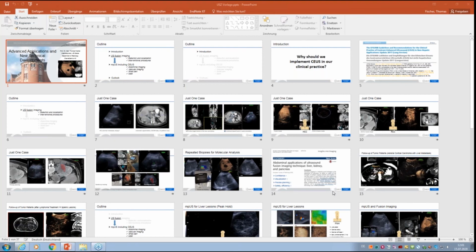Of course, in some cases, MR is superior. So we changed our setup. We used mostly ultrasound to control these patients. And if there is an unclear finding, we go to an MR scanner. That's our setup. So we skipped the CT evaluation. Of course, if you have a routine staging CT, whatever, we used ultrasound to correspond these findings after Bosniak.